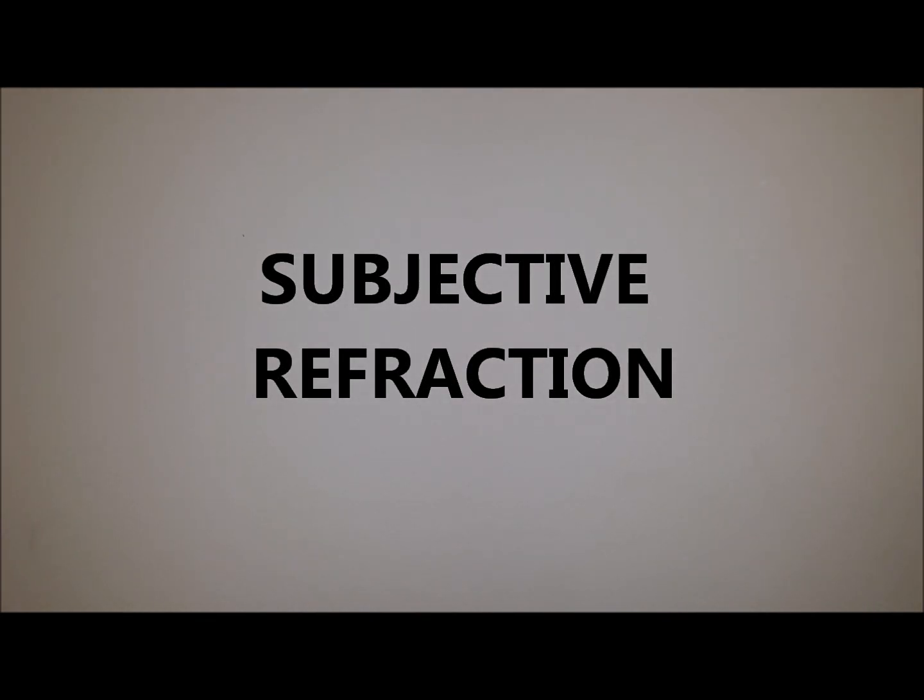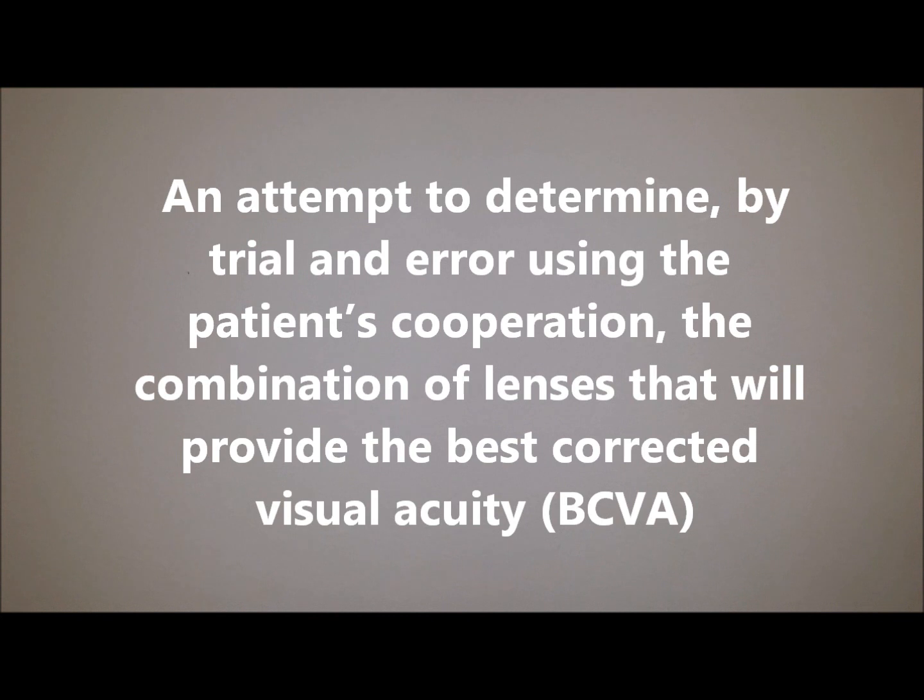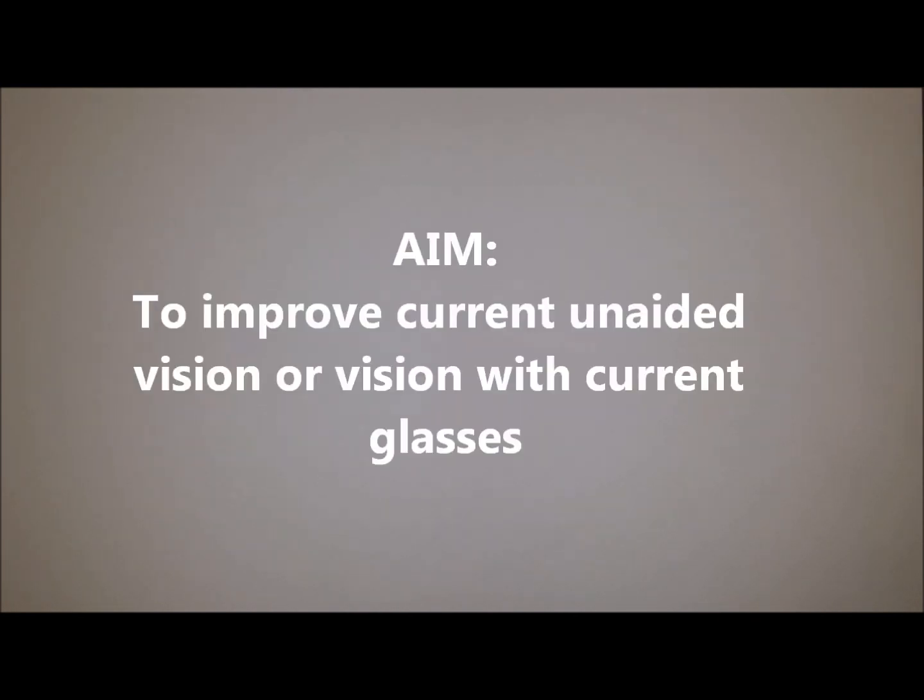This is an instructional video aimed at orthoptic students to further educate them about the clinical skill of subjective refraction. Subjective refraction is an attempt to determine, by trial and error using the patient's cooperation, the combination of lenses that will provide the best corrected visual acuity. The aim is to improve current unaided vision or vision with current glasses.